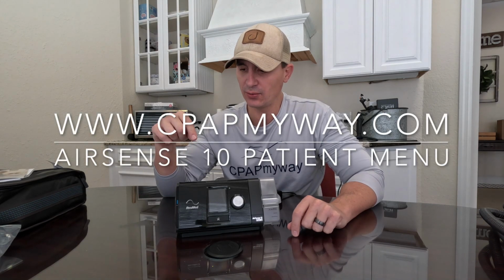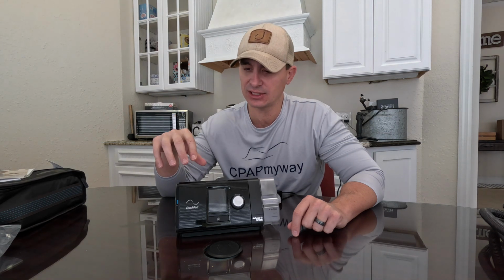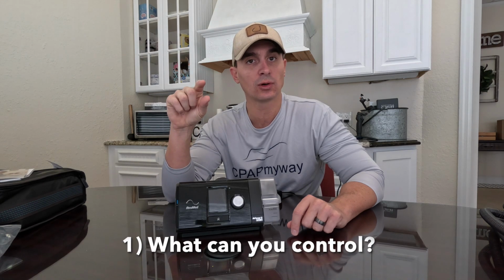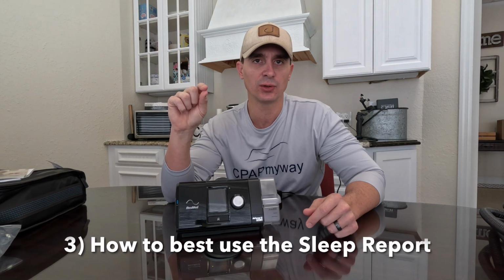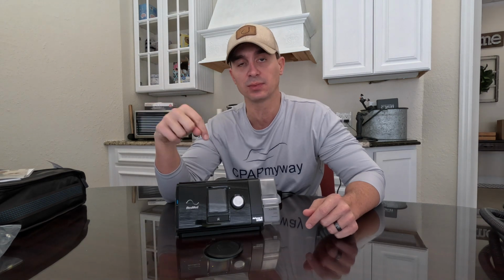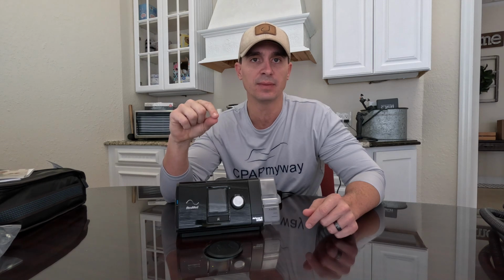Today I'm here to take you through a quick run through on your menu navigation and adjustments for the patient level of the AirSense 10. In this video, I'm just going to go over in the options what you can control, why you would adjust them and how to adjust them, as well as in your sleep report, what you're looking for and what you might can expect. Additionally, I'm going to show you real quick how to upgrade your sleep report in this particular video if you're only seeing the minimal information in the sleep report. So let's dive right in.